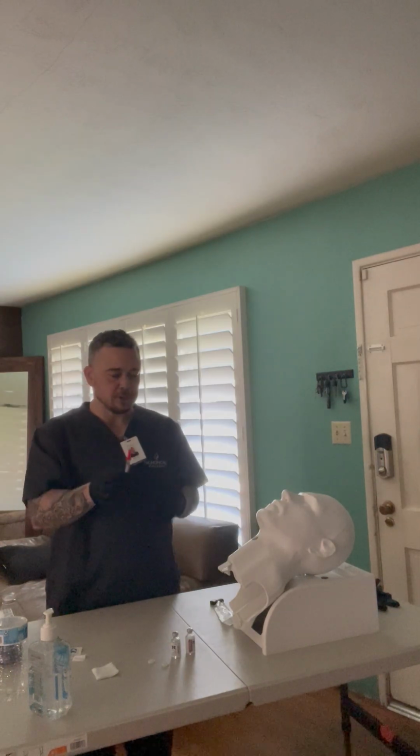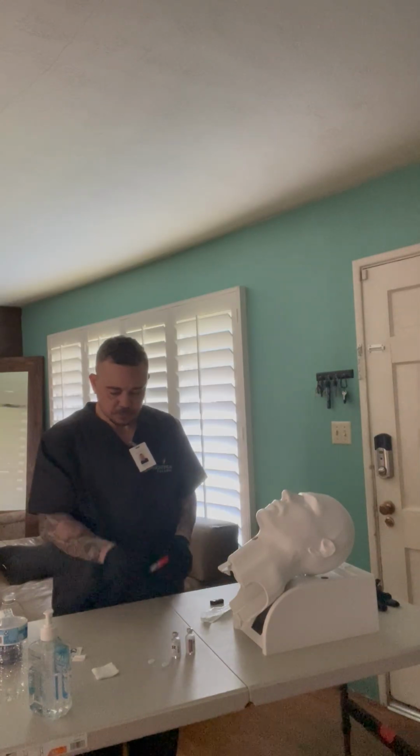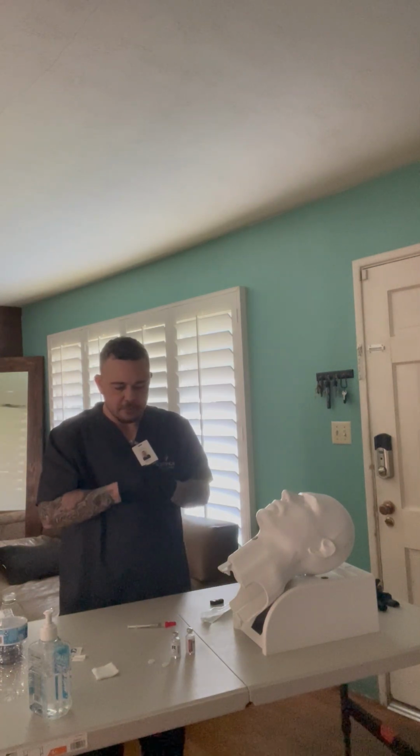Now, after I check the MAR to make sure it's set, the next thing I'm going to do is administer the medication to the patient. And once that is done, I'm going to take off my gloves.